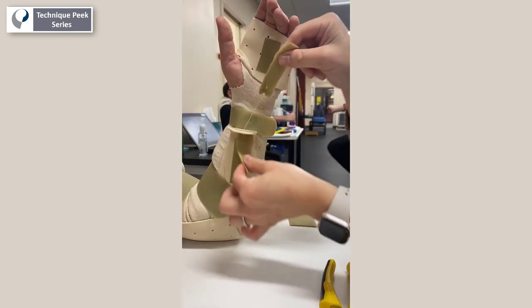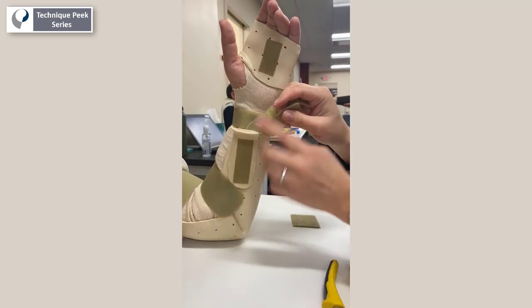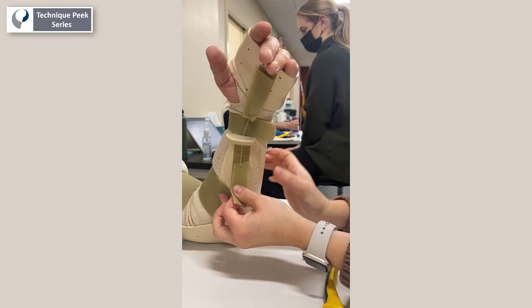Here you can see the completed dynamic strap. A strip of sticky-back loop at the top and the bottom of the splint allows you to statically and progressively increase wrist flexion and extension while using the splint.